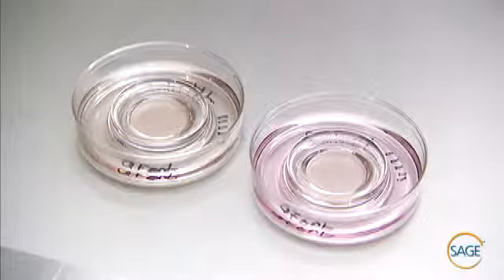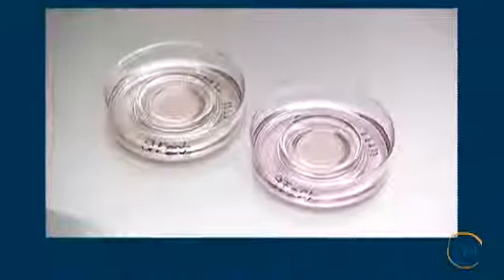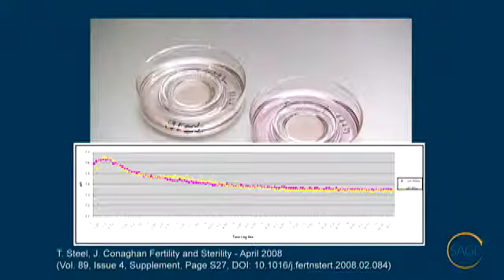Rapid deequilibration of both temperature and pH occurs after the removal of culture dishes from the incubator, usually in less than 10 minutes. Culture dishes re-equilibrate slowly due to the relative magnitudes of the differential CO2 contents between the equilibrated medium, the air, and between the incubator's atmosphere and the partially outgassed medium.